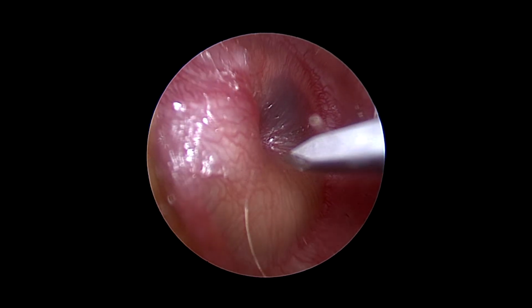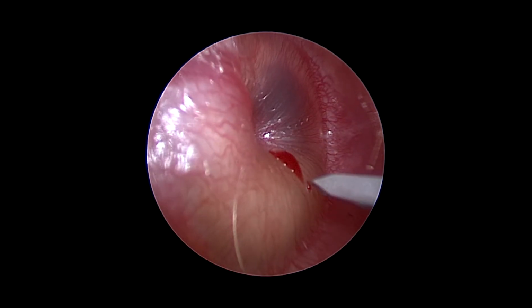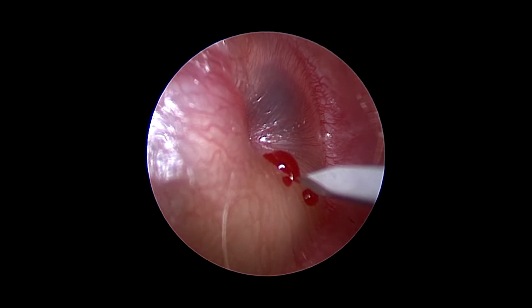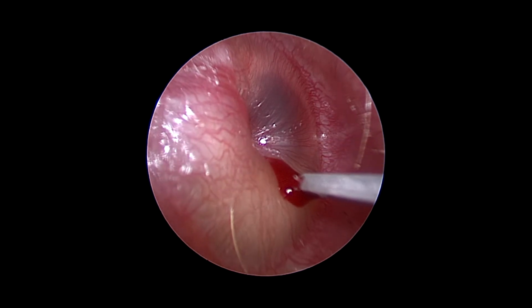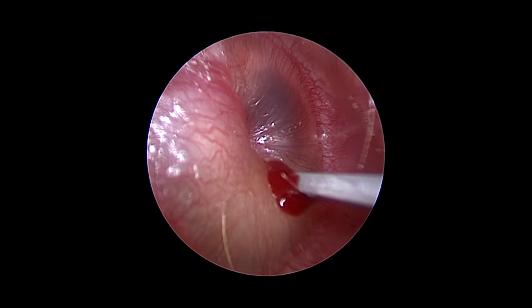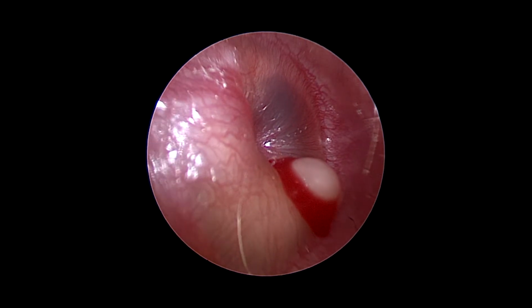The first step is to take the myringotomy knife and make an incision in the anterior inferior area. This is the safest area to make this and to place the tube. The knife, as you can see, is very sharp and these are microscopic movements. Once the incision is made, you're going to see the mucus pop up that was behind the eardrum.